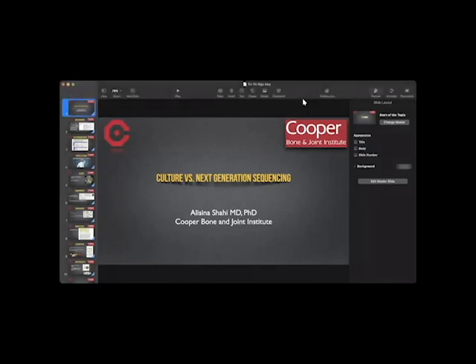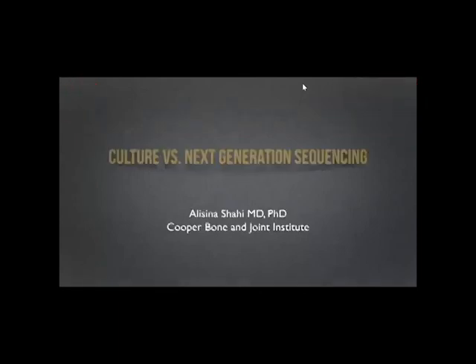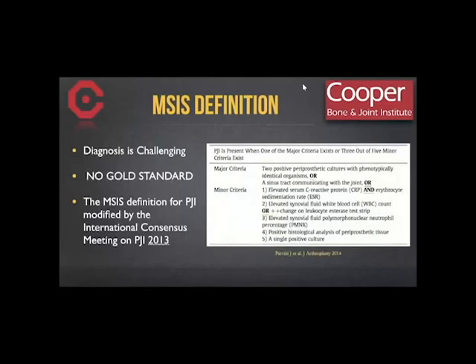Good morning, everyone. Thank you very much for being here. I'm going to go over culture versus next generation sequencing and what the differences are. Diagnosis of periprosthetic joint infection, PJI, is currently a very challenging problem. As you know, there is no absolute test. Hence, clinicians who encounter a suspected PJI case have to use a combination of tests, all of which, besides their expense, can be invasive, and even so they are far from perfect. In 2013, the MSIS came up with a set of criteria for defining PJI, which was then modified by the International Consensus Meeting.